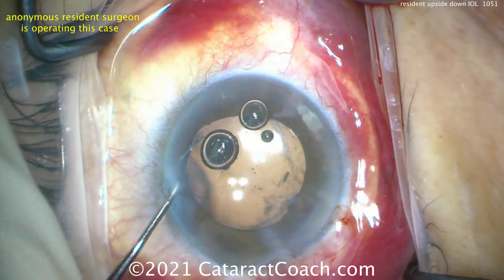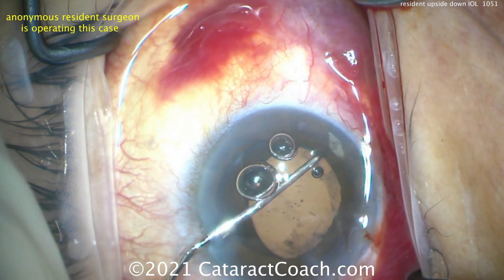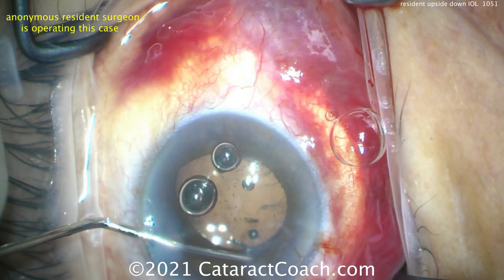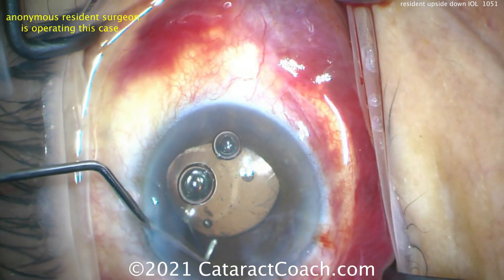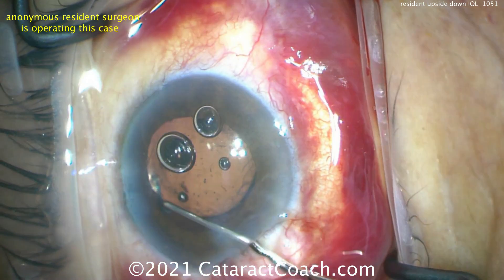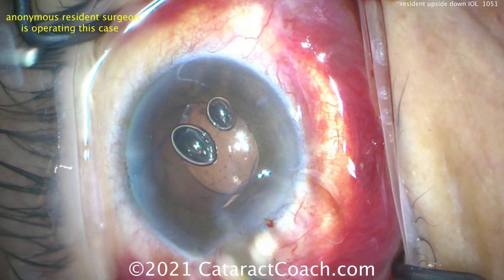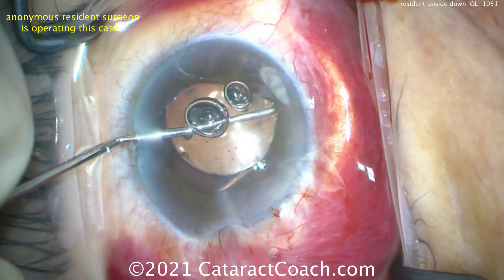Dialing it around — there's the second haptic — we'll get both in the sulcus, center the lens. Remember this has the correct posterior angulation because the haptics are angulated on the optic. It won't sit too close to the posterior surface of the iris; it'll sit in an appropriate position just in front of the anterior capsular rim. Dialing a little more to get better support, making sure it stays centered. That last haptic isn't quite in the sulcus yet — dial it in. Rotate a little more, ensuring the haptics are secure. If one haptic is behind the anterior capsule, you'll have a dislocated lens post-op. Bring it centrally — there you go. Still no vitreous prolapse, by some miracle.